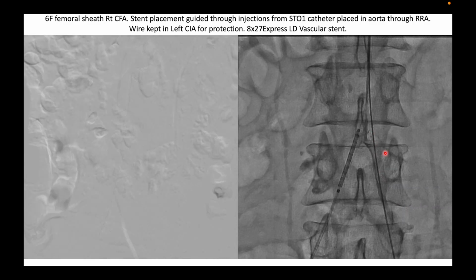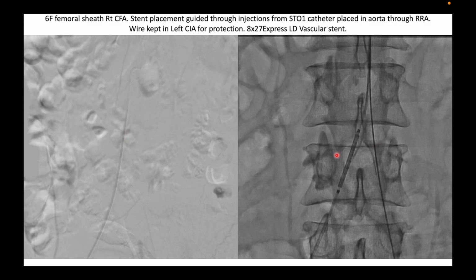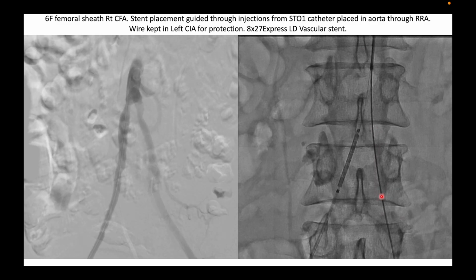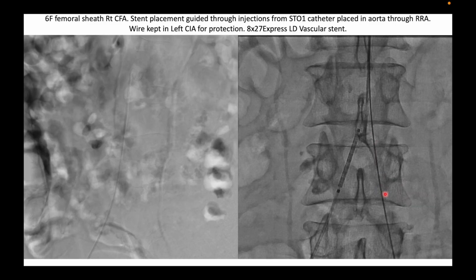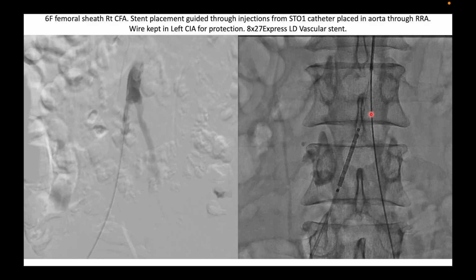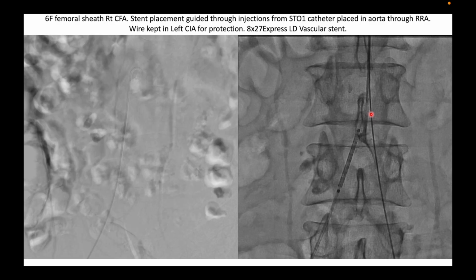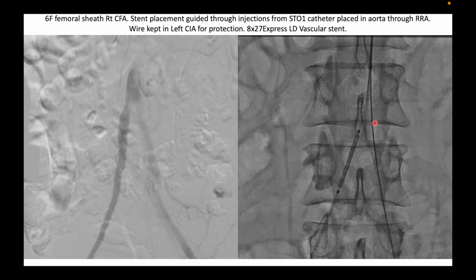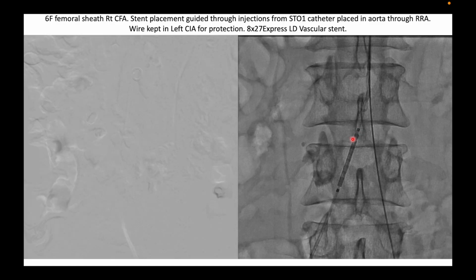So if this was a critical stenosis here, or I was more concerned about the disease here, I probably would not leave it just with a wire hanging there which is coming from the STO downwards. In this case, but otherwise I probably would have taken a sheath across this lesion and kept it here, so that there is no doubt that the stent, if required, will easily come in and we will not have difficulty crossing this if it is pinched because of this stent deployment.